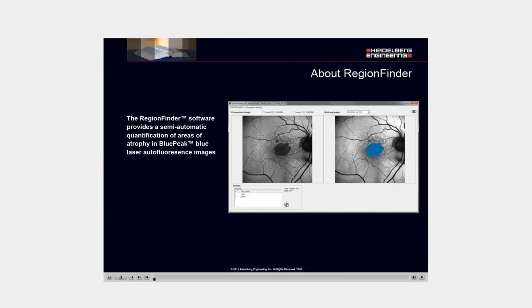The Region Finder software provides a semi-automatic quantification of areas of atrophy in blue peak blue laser autofluorescence imaging.